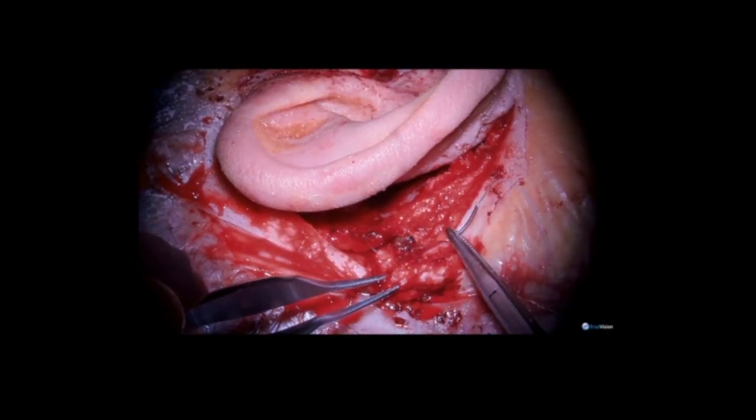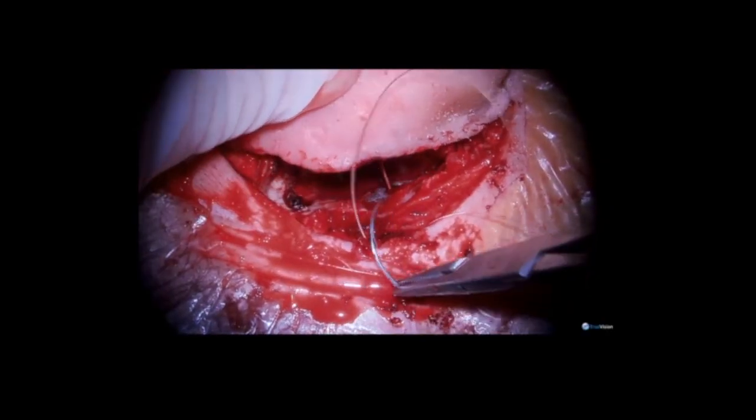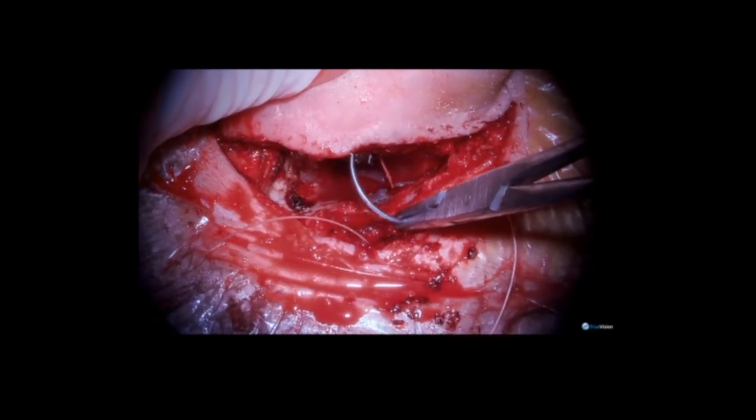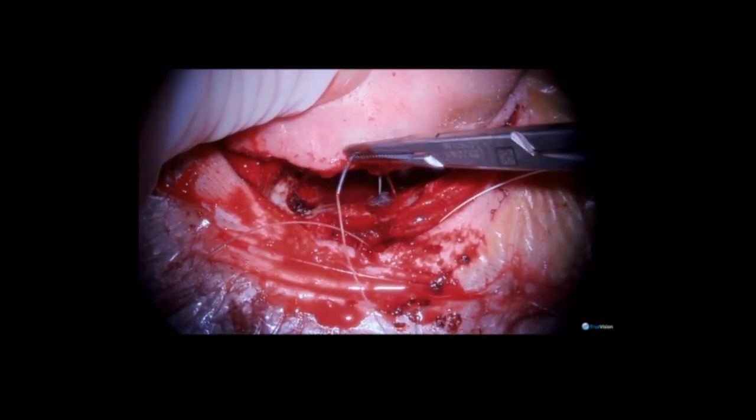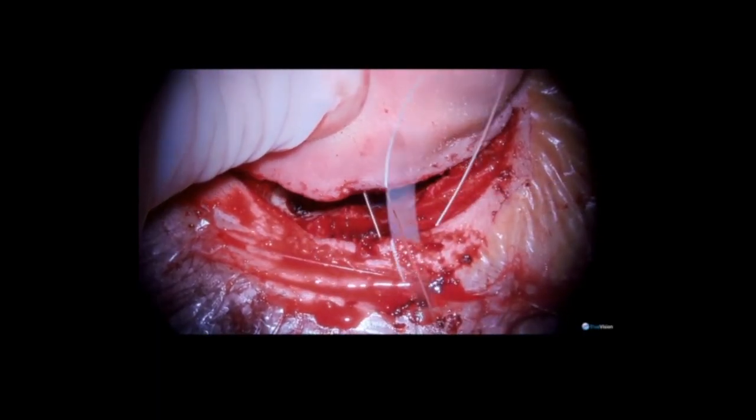I then use a 3-0 Vicryl to tack the center of the postauricular wound to add additional stabilization prior to packing the external auditory canal.